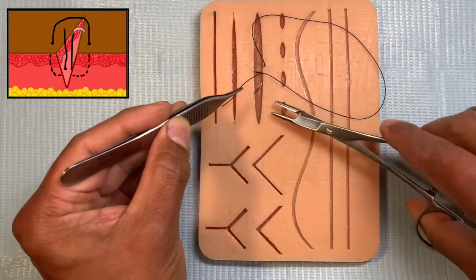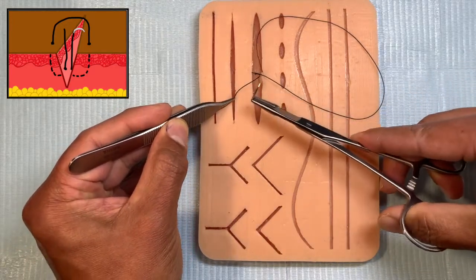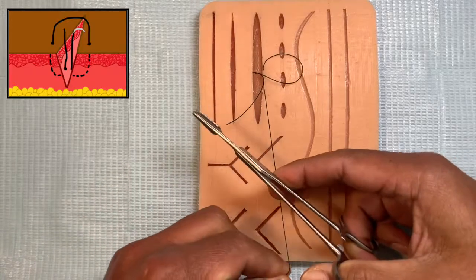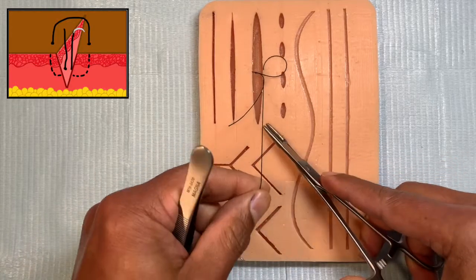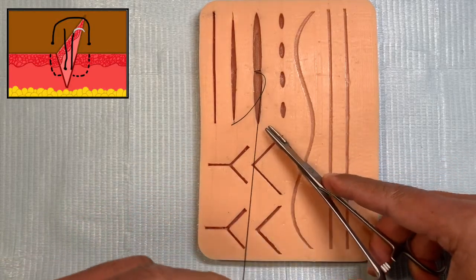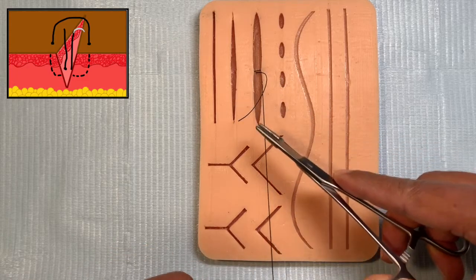So when you do this you keep the shorter end towards you because this should be sitting on the same side as where you're going to tie. So now we've got a shorter end and a longer end.